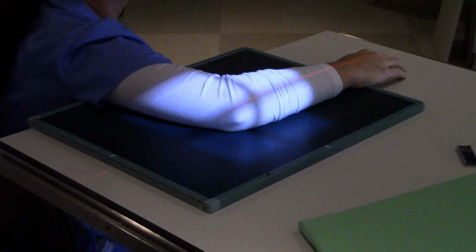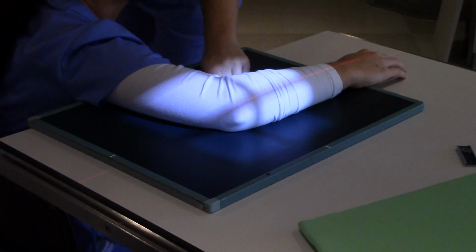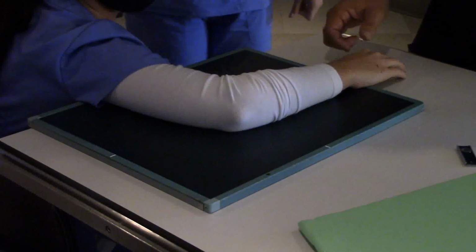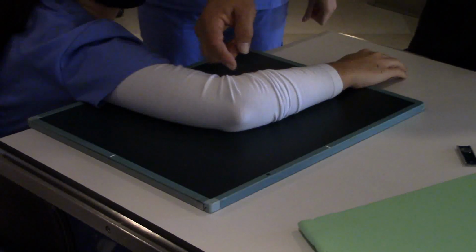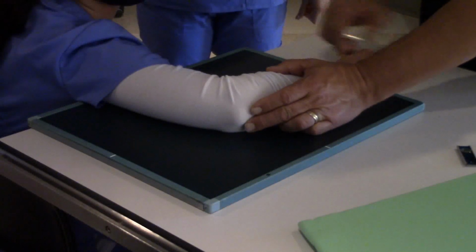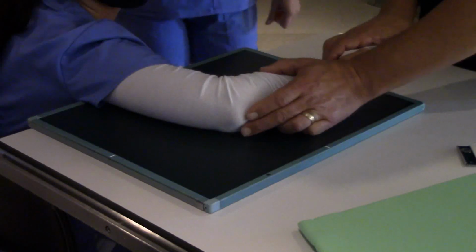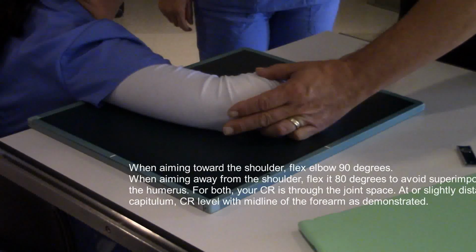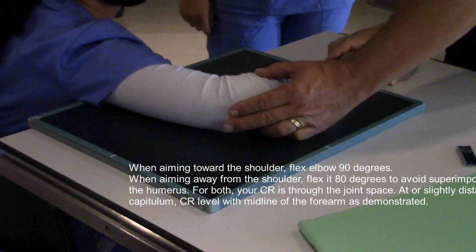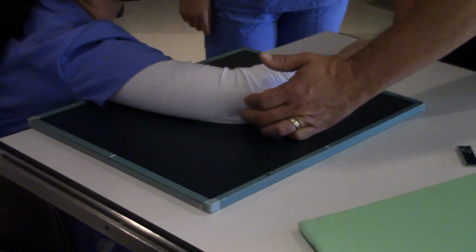And then for the other one, do I do it all the way, like on this side, and then you aim in through here? Yes, ma'am. Where would you center at? Your centering is going to be the same kind of thing for both. Now, for this one, it looks like we are basically 90 degrees. But for the other one, the reverse coil, because it's going in the reverse direction, you're not going to have quite as much flexion. You're going to open out a little bit more so that you can see.